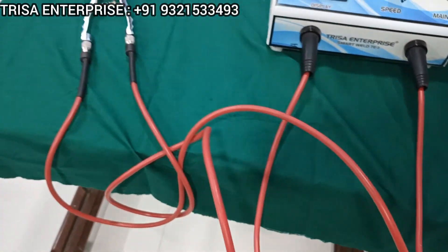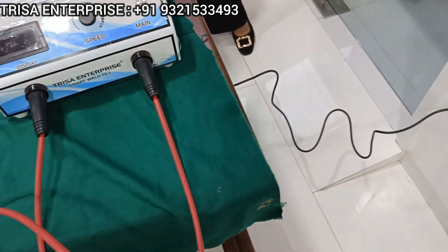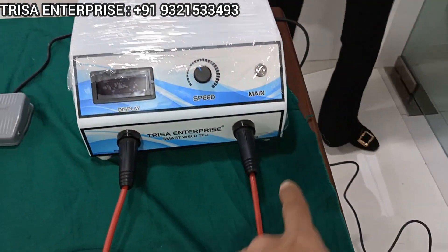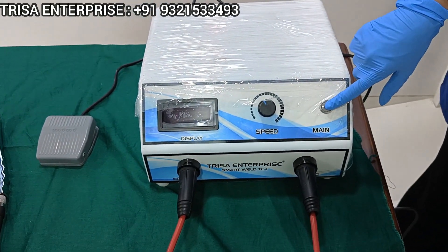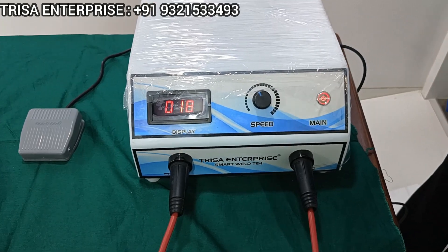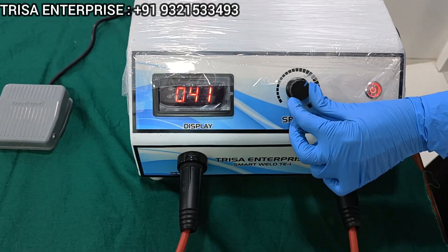The two pliers are connected — make sure everything is secure — the foot control connected, and now you can safely switch on the machine by starting the main switch. Once done, hold the mains button until the machine is switched on. Once the machine is on, you can use the speed control to regulate the intensity settings as per your need.